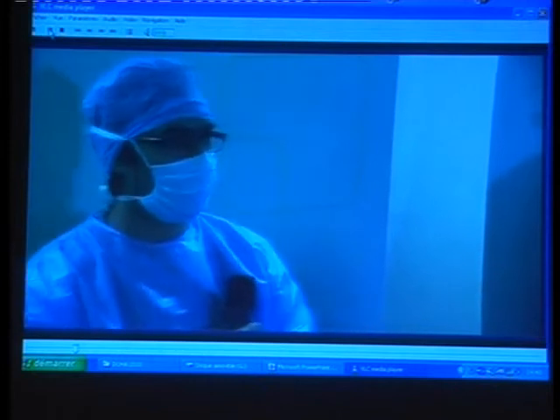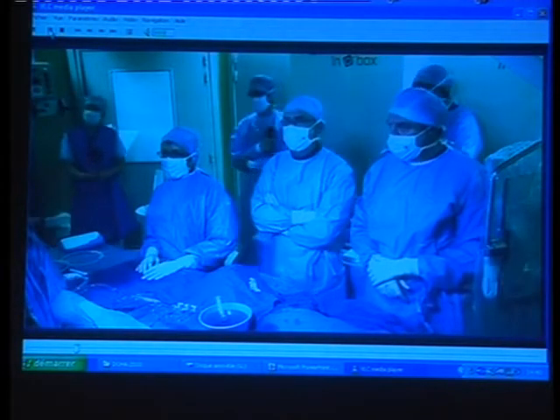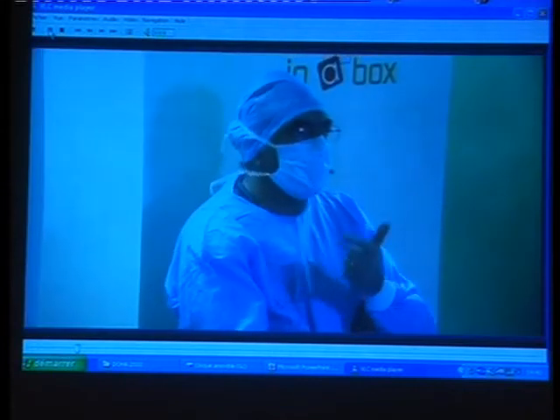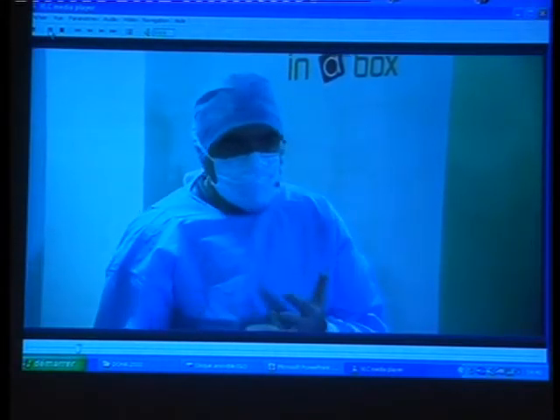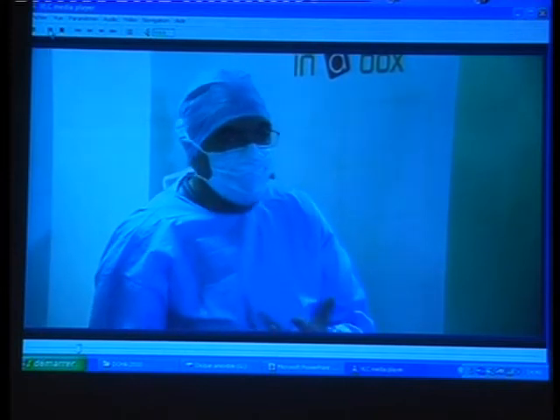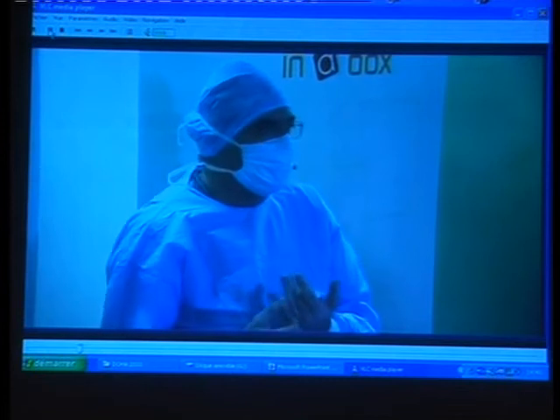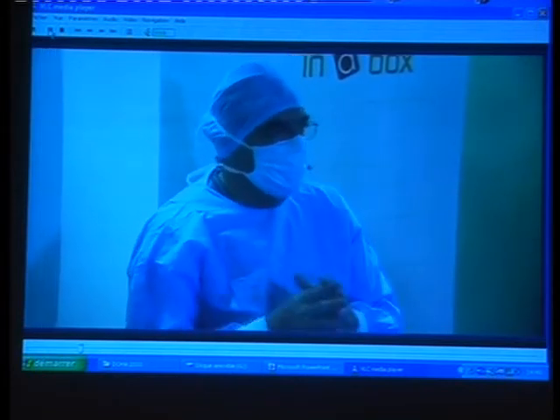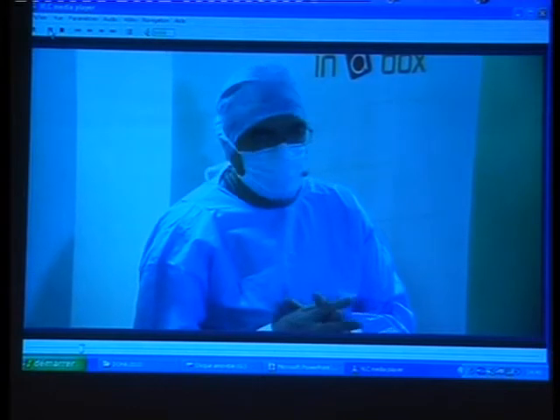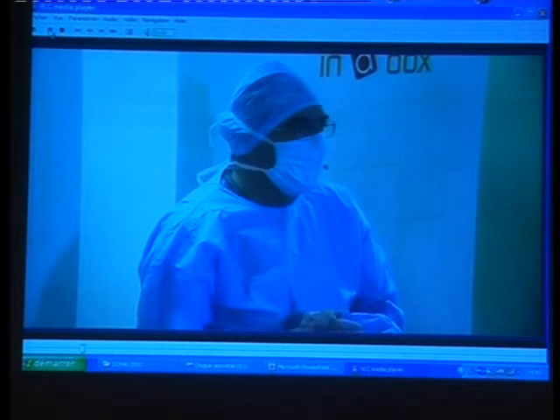Okay, thank you, Jean-François. So to summarize, this patient is a 73-year-old. He's diabetic. He has an acute coronary syndrome. He has angiographically three-vessel disease. The culprit lesion was treated with a stent implantation on our RCA, and we have today to take care of the left coronary tree.